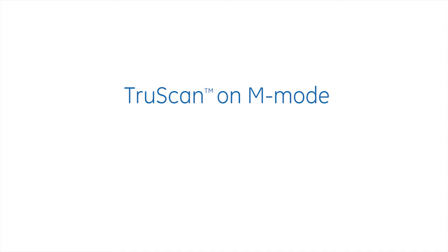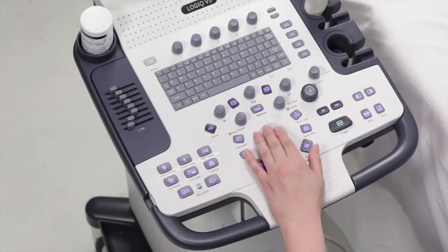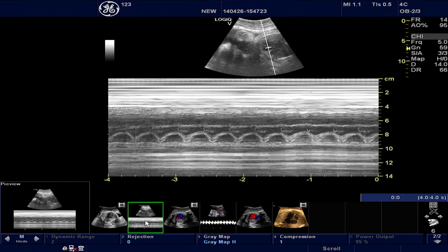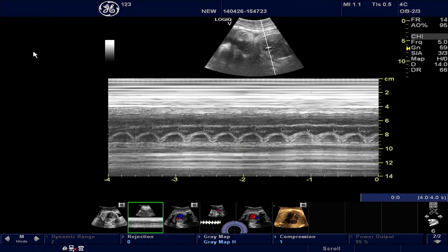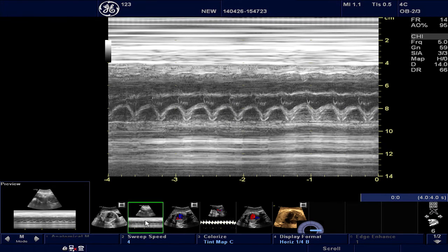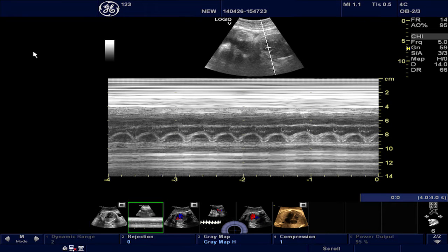TrueScan on M-Mode: Let's proceed to M-Mode now. Pull up the acquired M-Mode tracing image of the fetal heart. Use the M-Mode button to get an M-Mode tracing from a fetal cardiac image. The user can change the display format for better visualization of B or M-Mode.